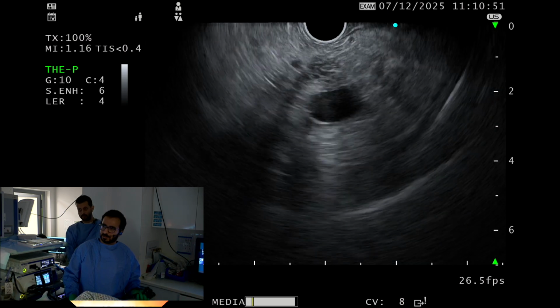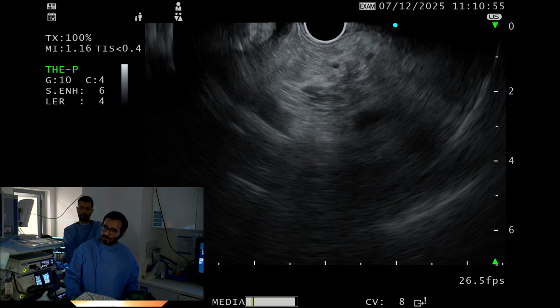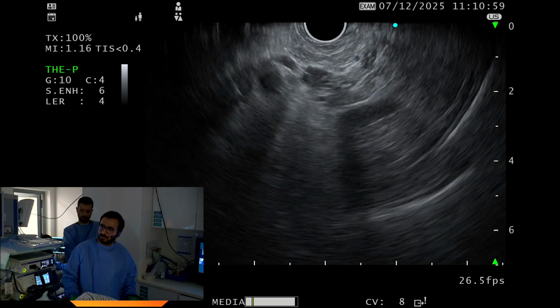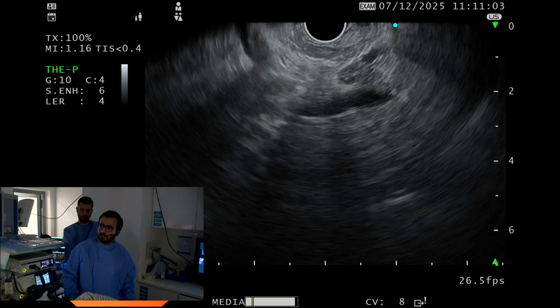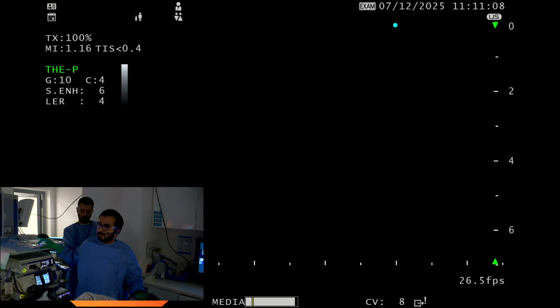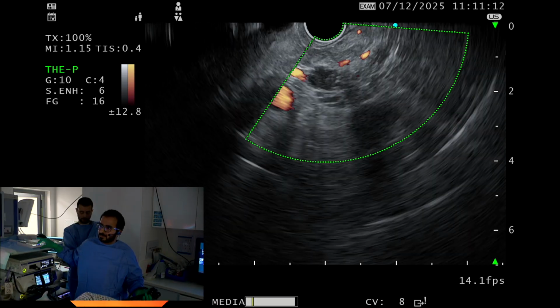And so the largest component is not too big. I think the yield from our diagnostic FNA will be relatively small in terms of fluid. And even if the CEA is borderline or high, the question then will come is, will you subject this young patient to a Whipple procedure, a total pancreatectomy, or just monitor? Because the cyst location is not just in the head of the pancreas. So those would be my comments.